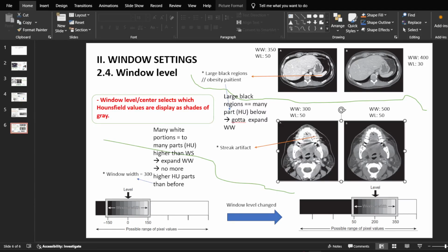The raw data goes to the doctor's computer, and you change it until you see the most beautiful image you can get from this data. The raw data is saved in your computer, so in case your image is not good enough, the doctor can open it and change it.